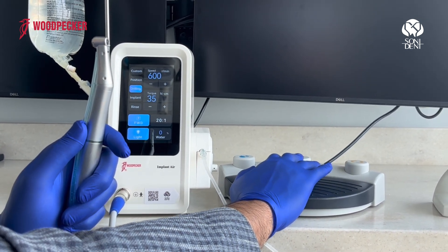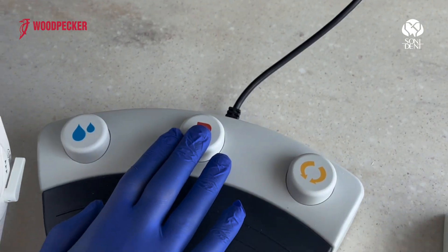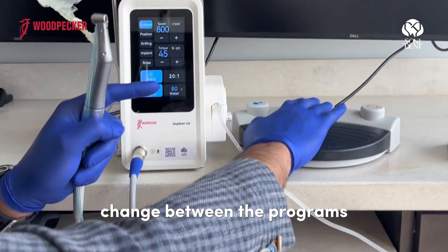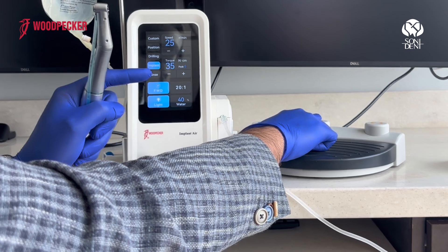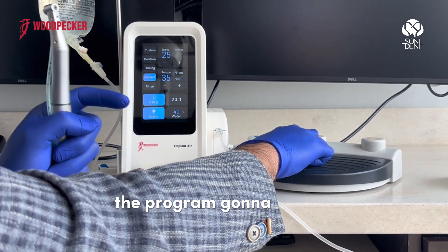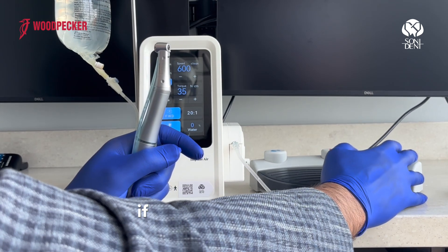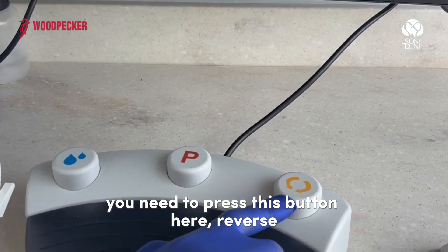By pressing the P key on the foot pedal, you can change between the programs. And if you long press on P, the program is going to go one step up. If you want reverse, you need to press this reverse button here.